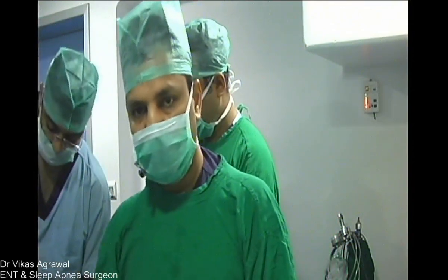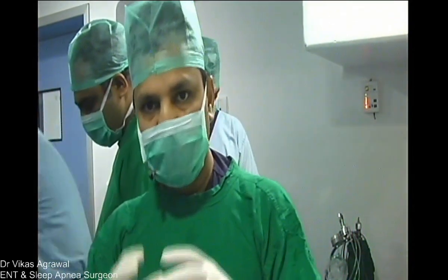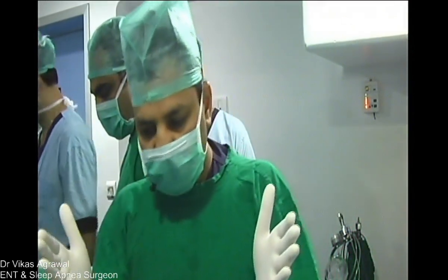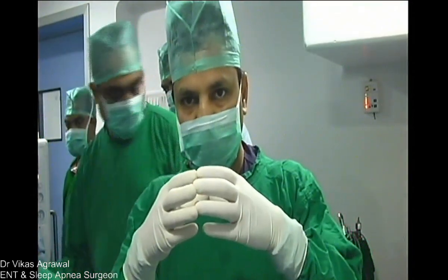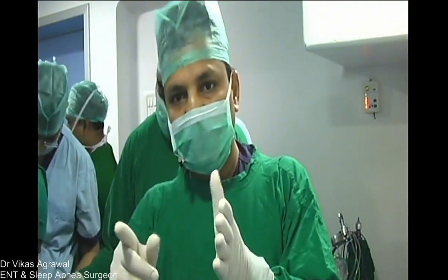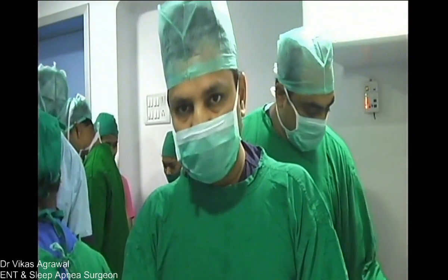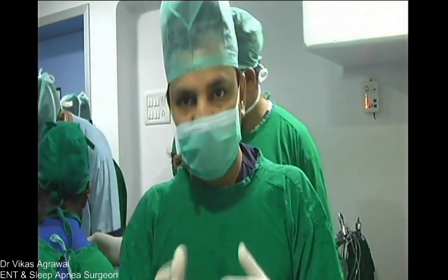I'll explain on table when I'm doing that what is my logic of tackling both lateral and AP collapse in all the cases, because when we are seeing a drug-induced sleep endoscopy, the palate is a collapsible tube. So it may collapse in this way, it may collapse in this way. We have seen that even in the same patient, in different stages of drug-induced sleep endoscopy, depending upon the depth, the pattern is changing.